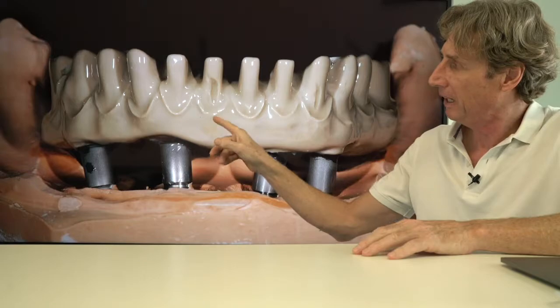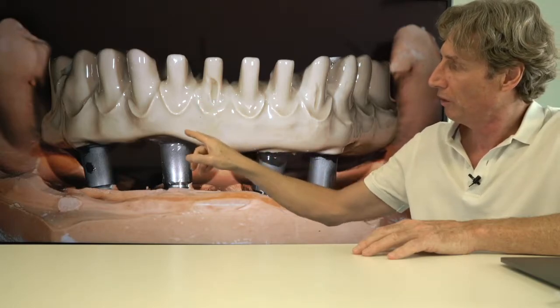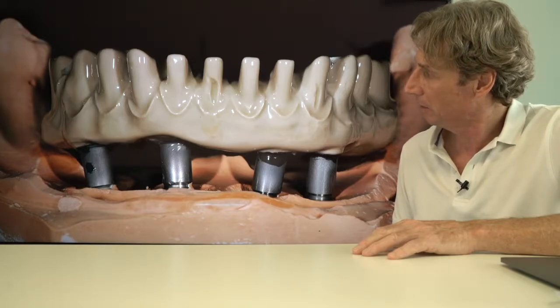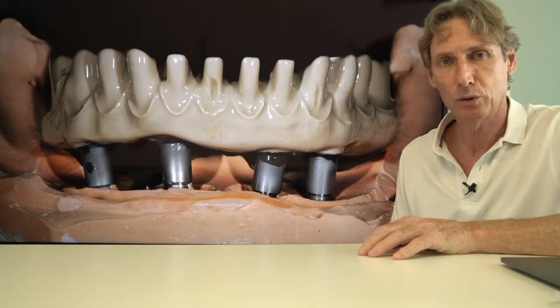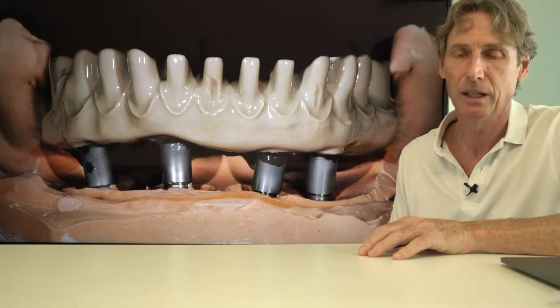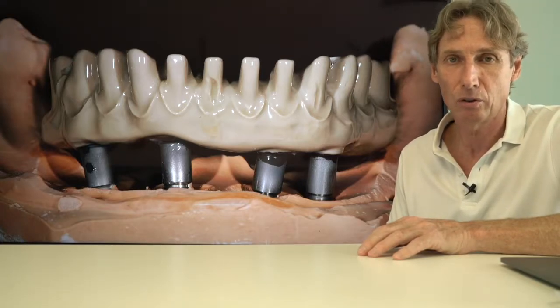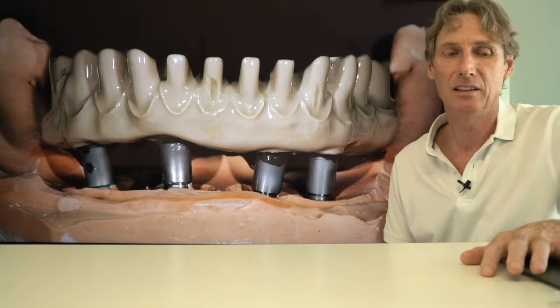So here another case. You see the prepared framework for the ceramic crowns for the pink aesthetics, and it's here the bonding is applied. That's why we have these reflections on the PEEK. This was a patient. We made a ceramic fused to metal bridge construction in the upper jaw more than 20 years ago, and in the lower jaw she had a full denture, a complete denture, fixed by 4 implants with O-ring attachments. She asked us if we can offer her a fixed solution in the lower jaw.